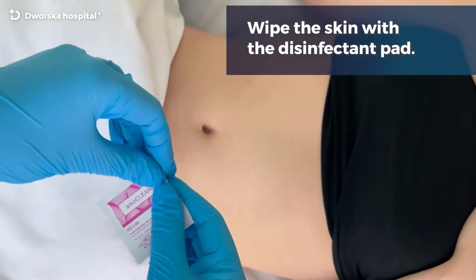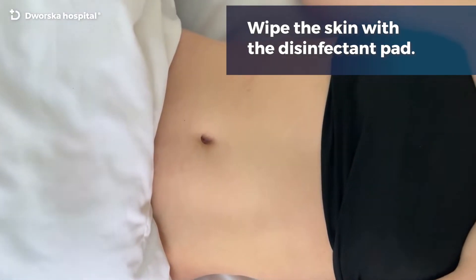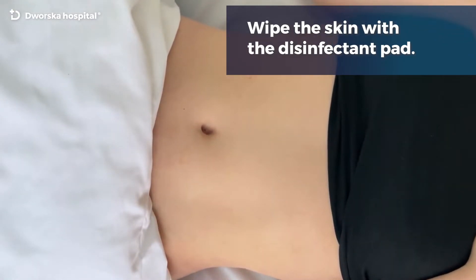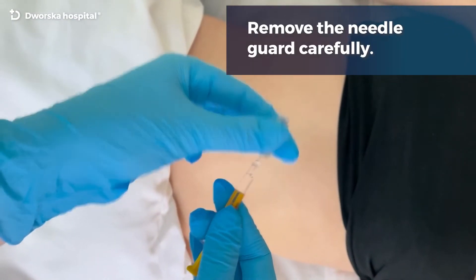Wipe the skin with the disinfectant pad. Remove the needle guard carefully.